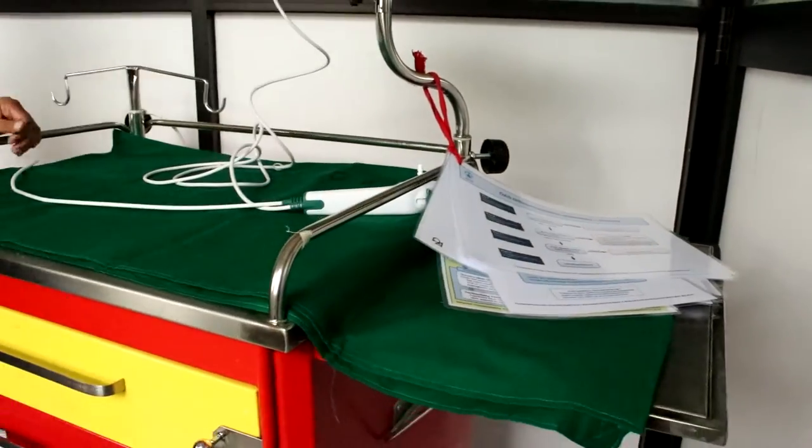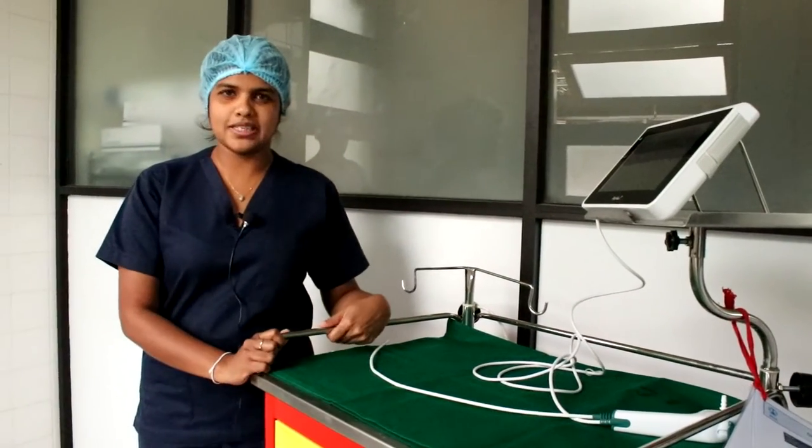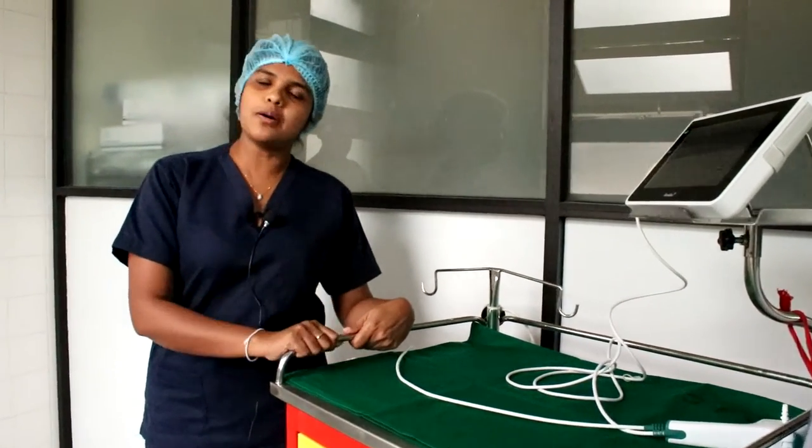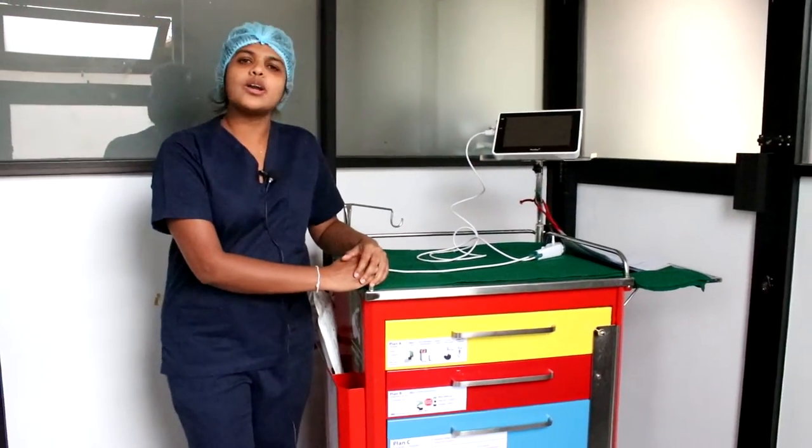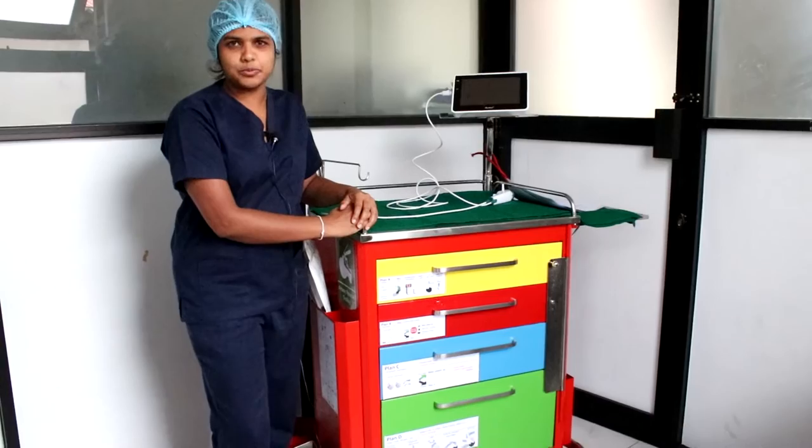So this is the difficult intubation trolley. When you come for your shift, make sure that you get familiarized with the contents and go through our videos and educational program on how to manage difficult intubation.